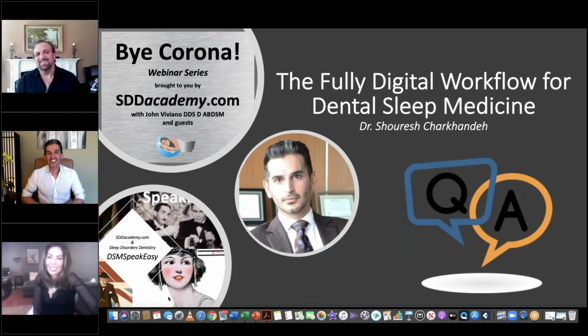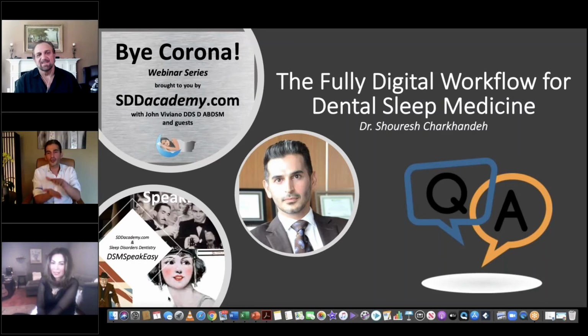I like answering questions in different ways. John can jump in on this one as well. That's what I like about webinars. You get very big questions, which we're supposed to answer in a very limited amount of time. Let's start by talking about, can you, that's probably what I'm hearing, test different verticals with Matrix Plus. That's one of the biggest questions. The Matrix itself does not do vertical adjustments, not live vertical adjustments.